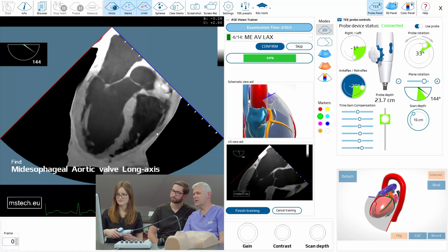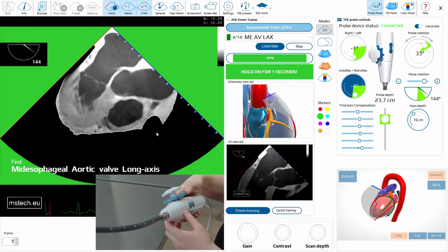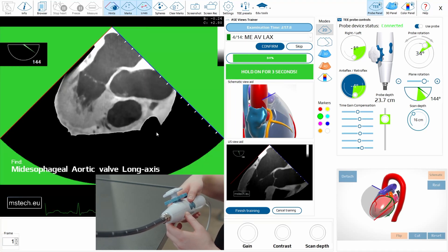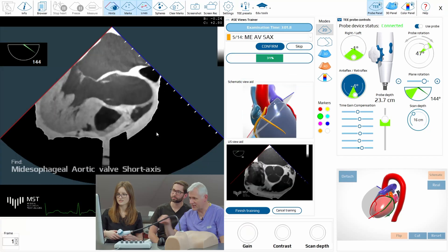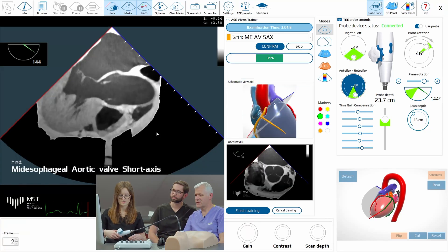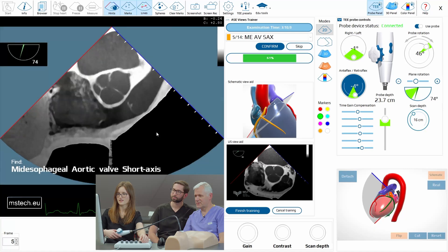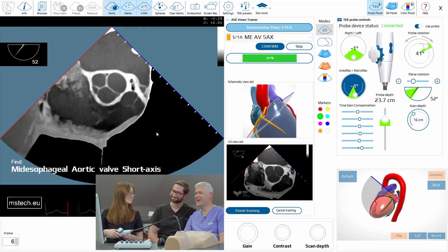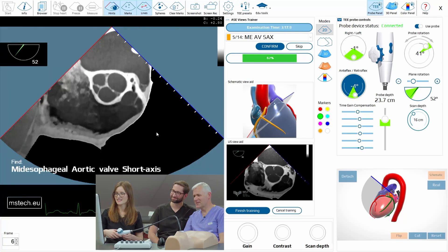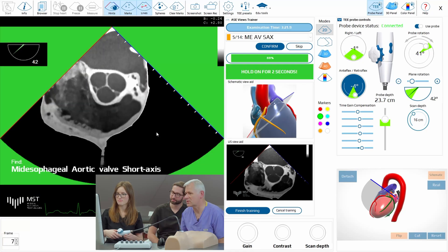Now the aortic valve. So you have to release the retroflex and show the aortic valve in long axis. Short axis — yeah, a little bit more. Perfect. Now short axis. So we should go the other way. Yes. Are you sure you've never done this before? Never. Short axis — slightly too high angle, maybe we should decrease it a little bit more.